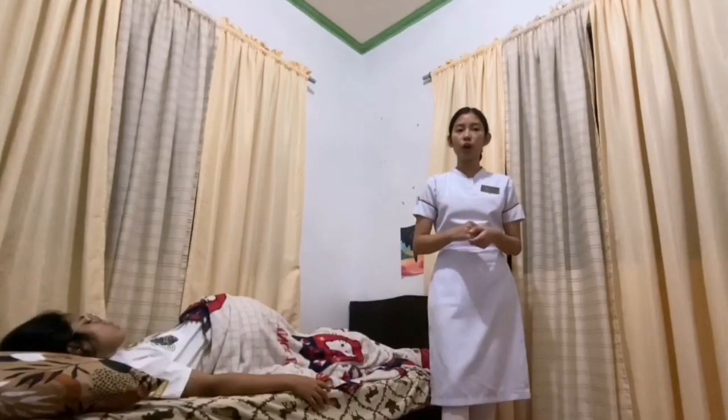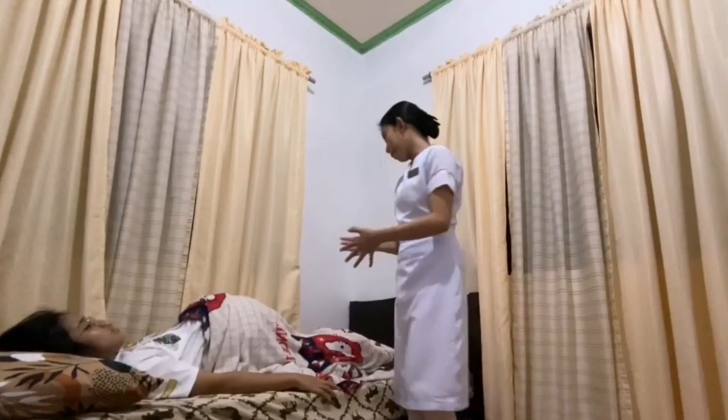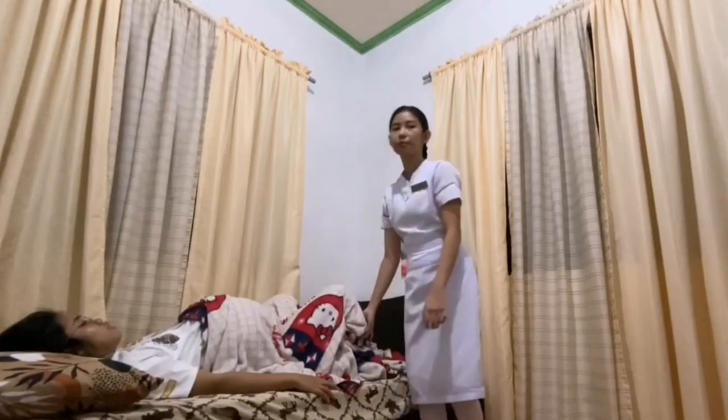For assisting in normal spontaneous delivery, the first thing is to ensure all delivery equipment and supplies are available and place the delivery area clean and warm at 25 degrees Celsius. After that is to ensure the bladder is empty. Ma'am, would you like to use the comfort room first? No, thanks. Okay. Assist the woman in a comfortable position. The first stage of labor, or the dilation stage, begins with onset of true labor and ends when the cervix is fully dilated at 10 centimeters.